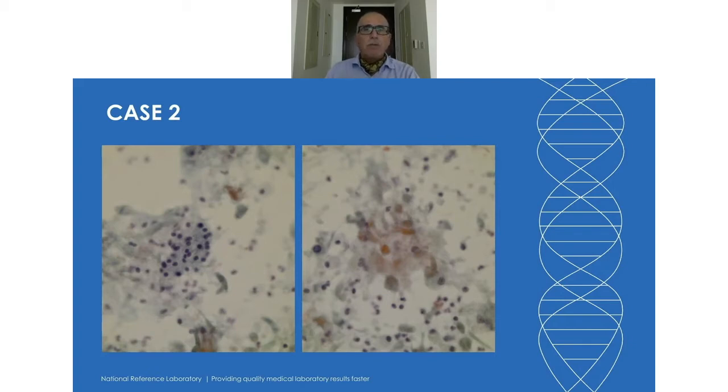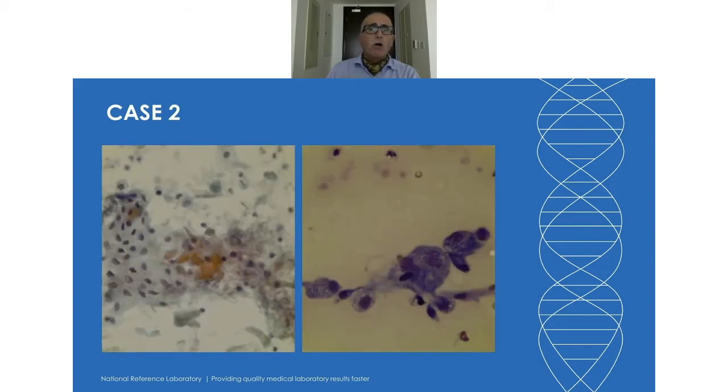There were polymorphs, there were lymphocytes as well, and then there were poorly preserved cells or ghost cells, which in some areas looked slightly more squamoid, but we couldn't see atypical squamous cells. We could see squamous cells, but this orangophilic material, we were never sure whether it was just debris from the cystic background, and they were mixed with histiocytes, macrophages, and reactive cells on the whole.